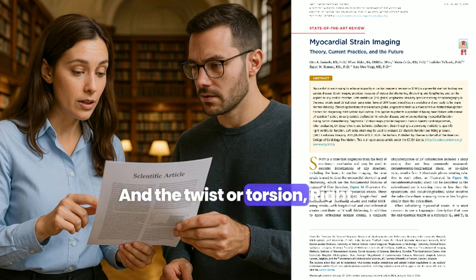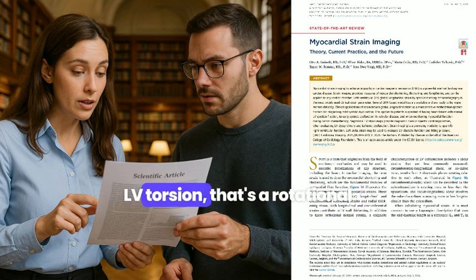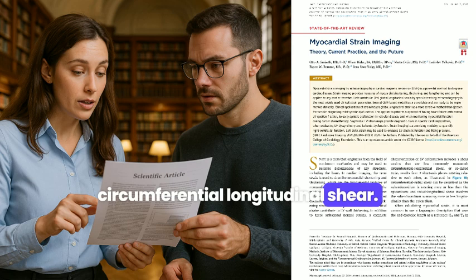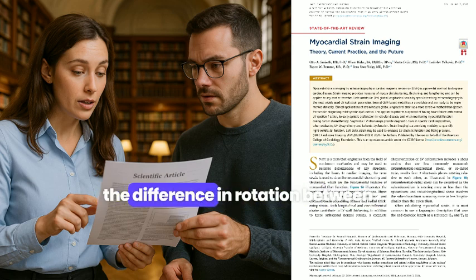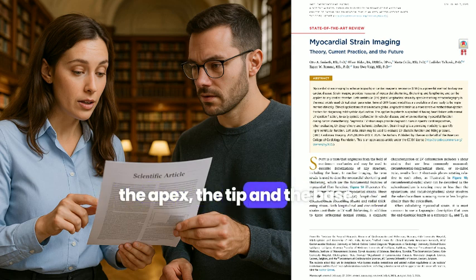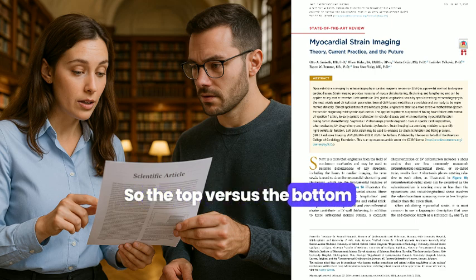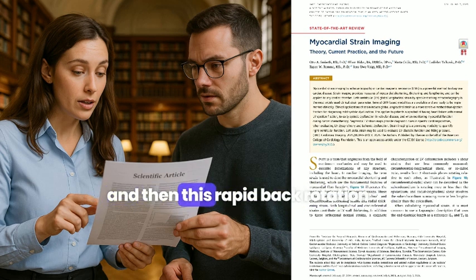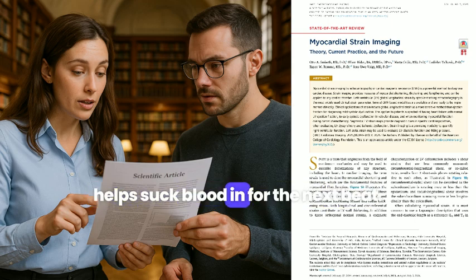And the twist, or torsion. Right, LV torsion. That's a rotational deformation from that circumferential-longitudinal shear. We measure it clinically as the difference in rotation between the apex, the tip, and the base. So the top versus the bottom twists differently. Exactly. You get apical rotation during systole, and then this rapid back rotation, untwisting, in early diastole, which helps suck blood in for the next beat.